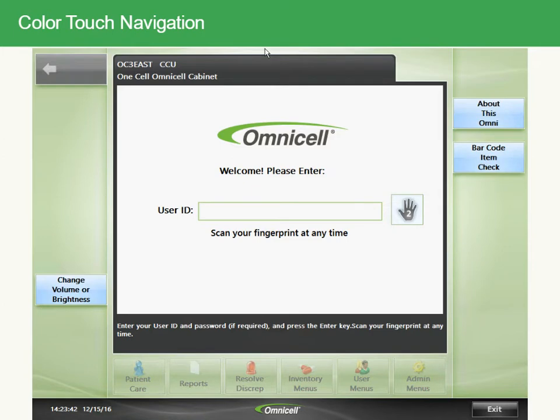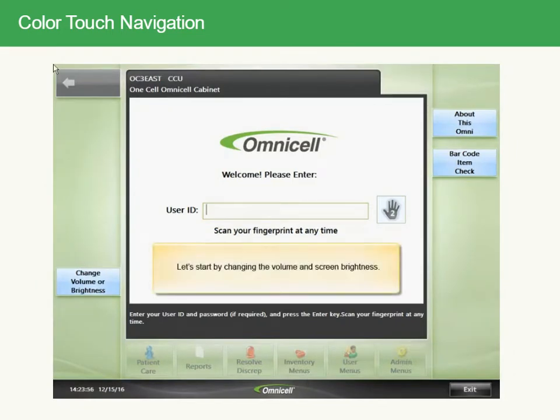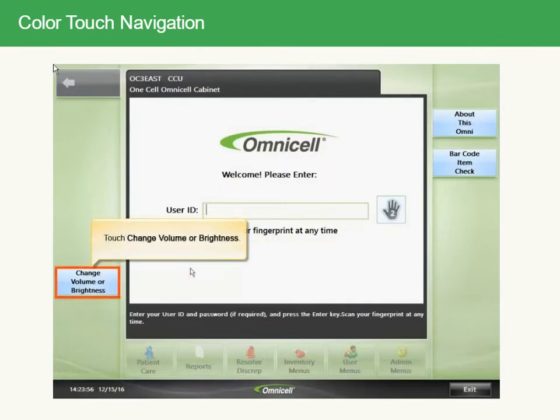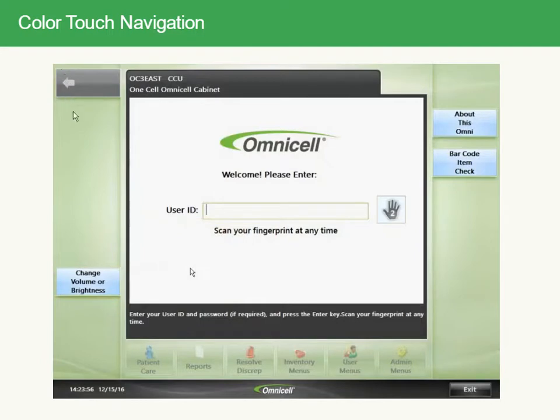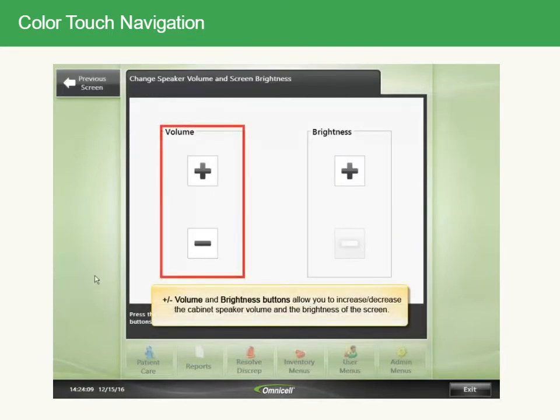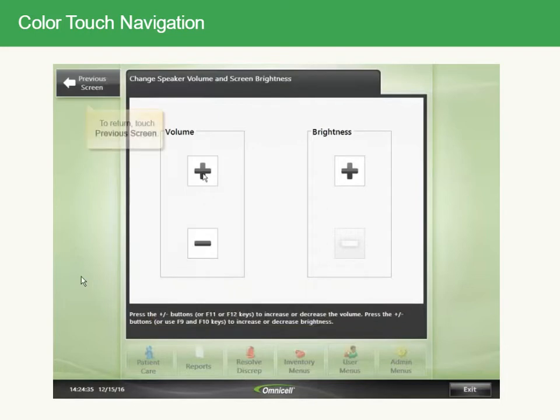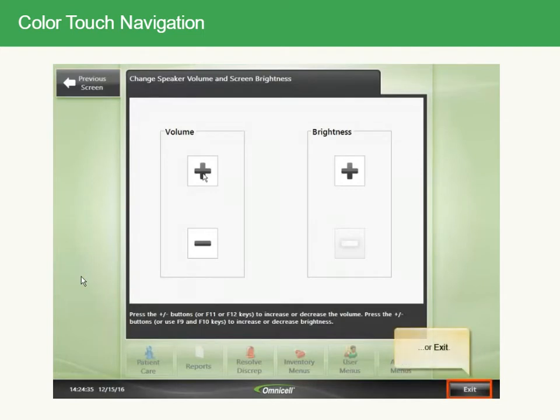There are many functions accessible from the login screen that you don't have to be logged on to access. Let's start by changing the volume and screen brightness. Touch Change Volume or Brightness. The plus or minus buttons allow you to increase or decrease the cabinet speaker volume and the brightness of the screen. To return, touch Previous Screen or Exit.